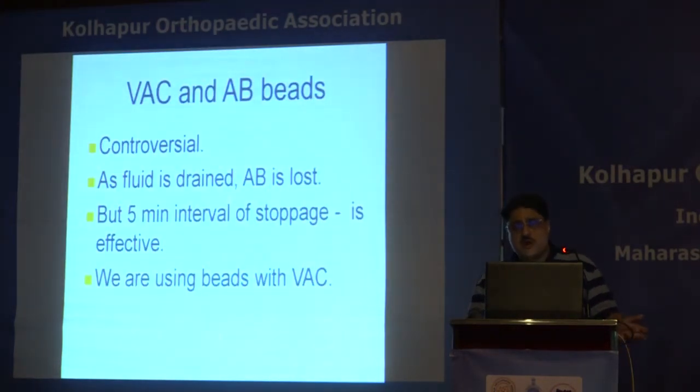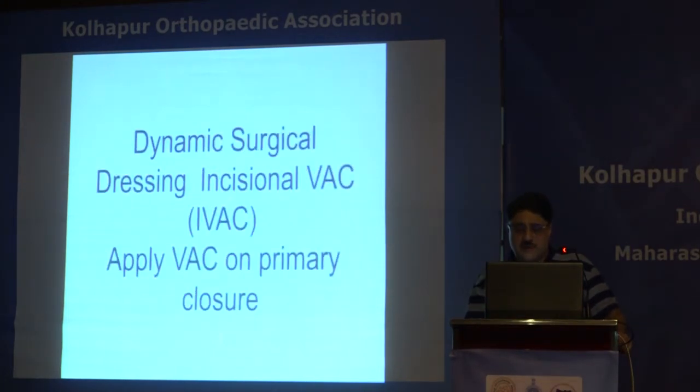So whether to use a VAC with antibiotic beads is a controversial thing, because whatever antibiotic is leaching out will be sucked out by the machine, or the VAC. So the antibiotic is lost. Initially we thought so, but now we have seen that it is much more helpful. Some antibiotic may be sucked out, it doesn't matter, but whatever is there inside will also help to cure the infection. So a 5 minutes interval is effective. We are now using antibiotics with the VAC as well.